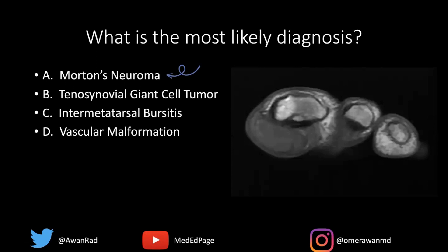Is this a Morton's neuroma, a tenosynovial giant cell tumor, intermetatarsal bursitis, or a vascular malformation? What's the most likely diagnosis?